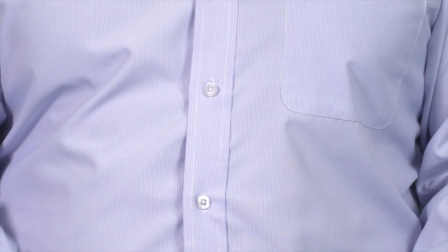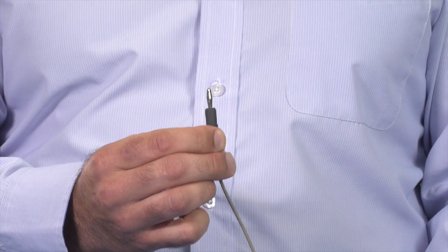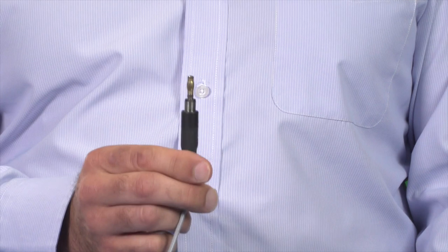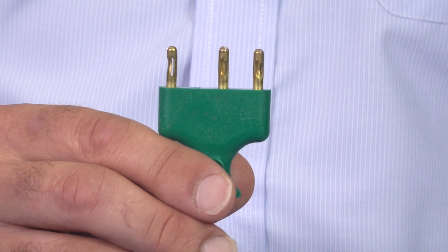The most common monopolar plugs include the 3-pin international standard plug, the 4mm banana plug, the 8mm Bovee standard plug, and the 5mm Irby standard plug. The most common plug is the so-called 3-pin international plug.